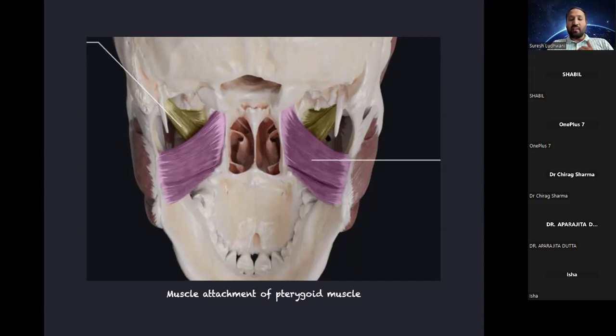So, as per most of the literature I could read, and as I told you, I will be sharing most of the good articles which I found, it should engage the junction of the pterygoid plates. It shouldn't go beyond. There are people who say it should go 2 mm beyond. No, there is no scientific data which supports that we should do it.